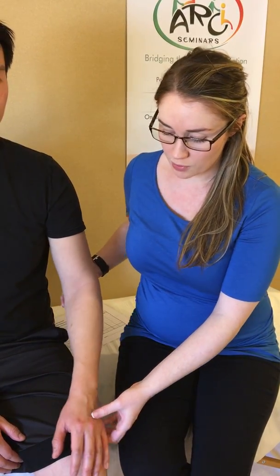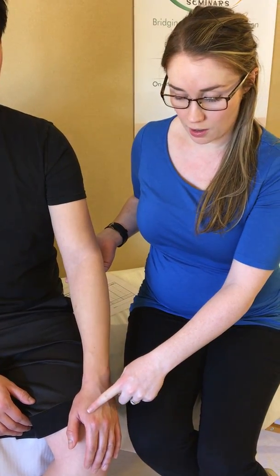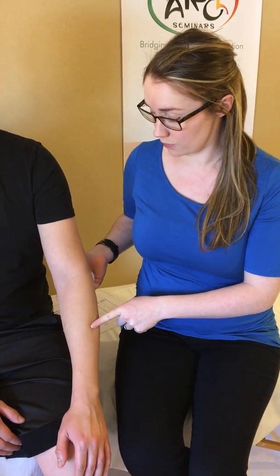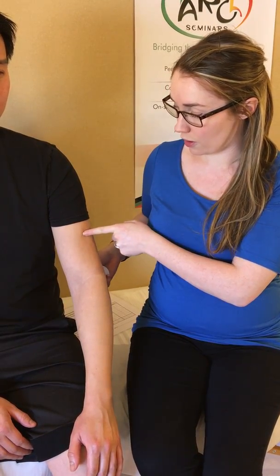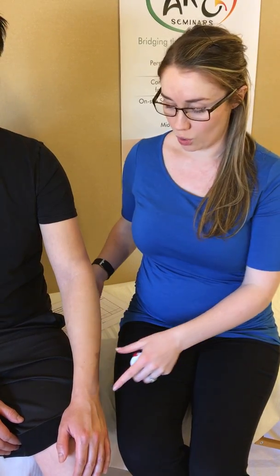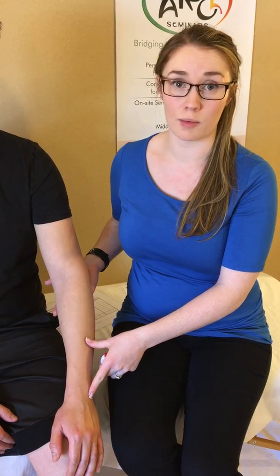When you're measuring the upper extremity, the anatomical landmarks that you want to notice are the palm, the wrist, mid forearm, across the elbow, mid upper arm, and the axilla. I'm now going to go through and measure this arm and show you some examples of where you might run into trouble, or some tips on how to work with your patient who has a swollen arm unlike this one.